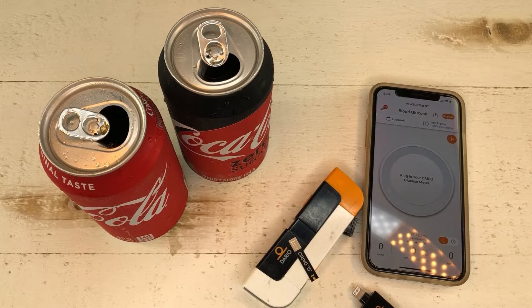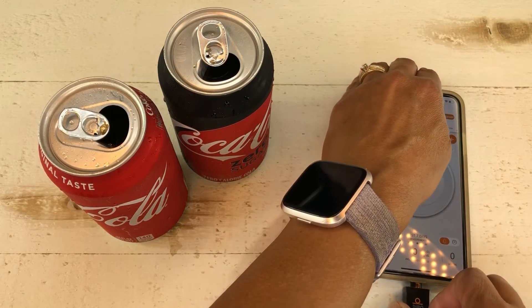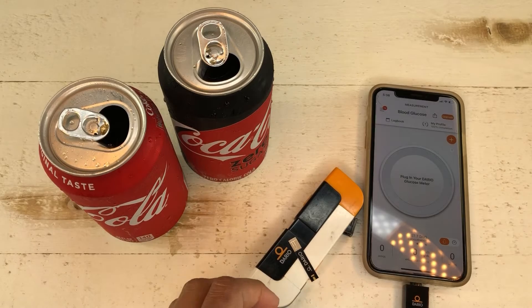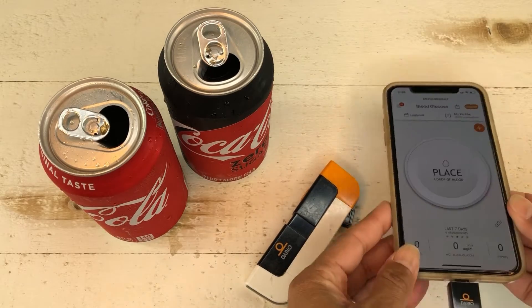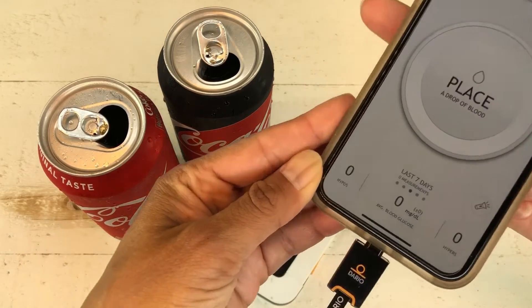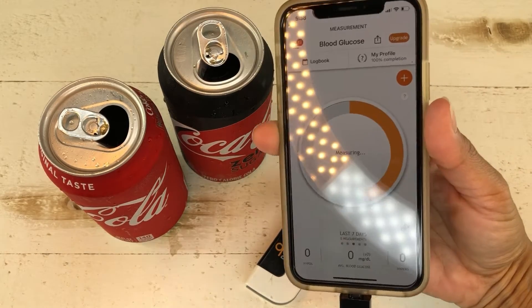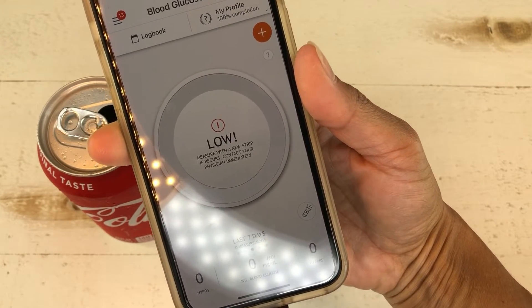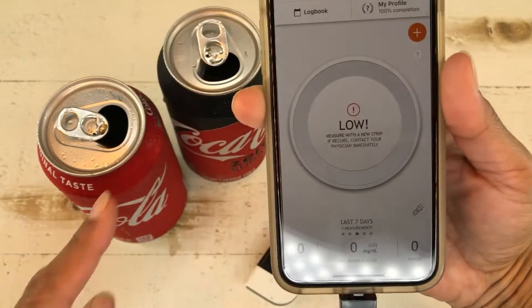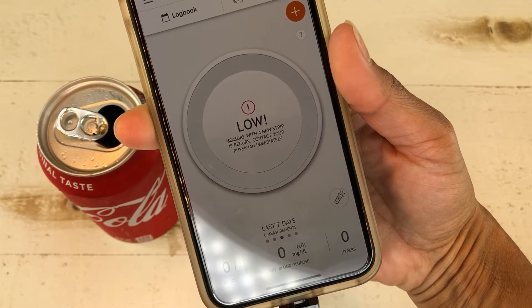Now we're going to test the Dario meter. I insert the meter and the strip - I've never tried this before - and now it says 'place blood drop.' I put it into the drink and let's see what it says. It worked! It recognized the Coke Zero as a non-sugar drink. Let's try the regular Coke.